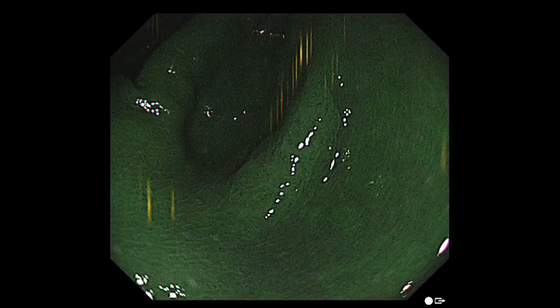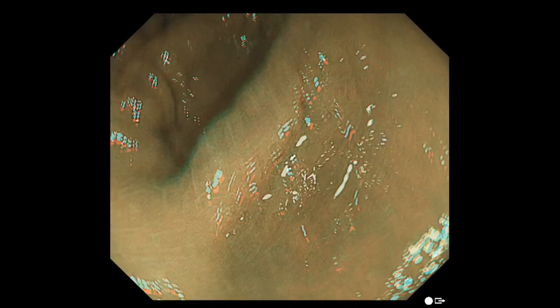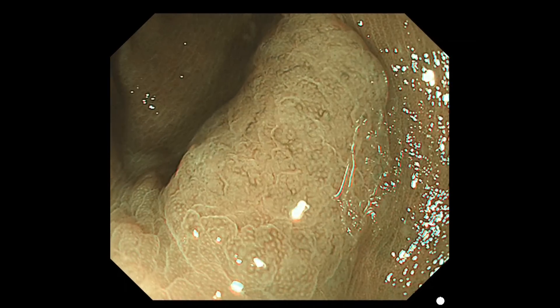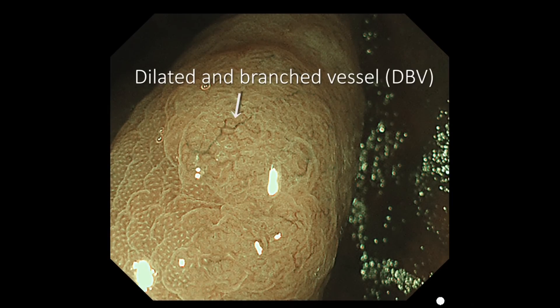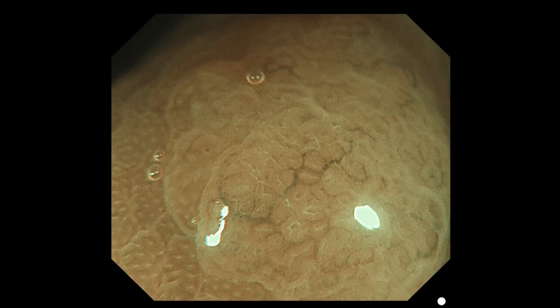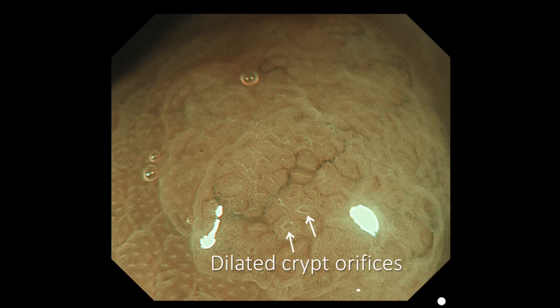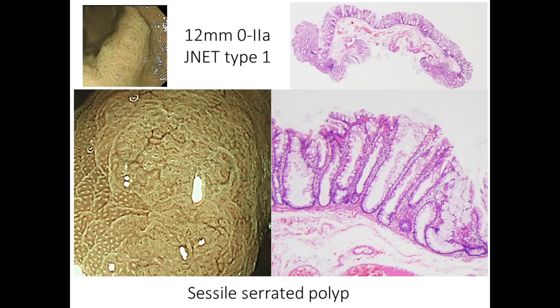This case is also a slightly elevated polyp, 12 mm in diameter. Magnifying NBI shows dilated and branched vessels, as well as regular dark spots in the expanded crypt orifices. These findings are specific to sessile serrated polyps. This polyp was resected by EMR, and the histopathology showed marked dilation of crypts with inverted T-like glands. Dilated glands were also observed at the bottom, so the pathological diagnosis was sessile serrated polyp.